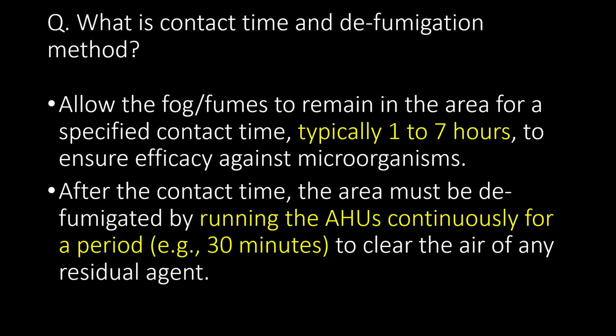What is contact time and defumigation method? Allow the fog or fumes to remain in the area for a specified contact time, typically 1 to 7 hours, to ensure efficacy against microorganisms. After the contact time, the area must be defumigated by running the AHUs continuously for a period, for example 30 minutes, to clear the air of any residual agent.